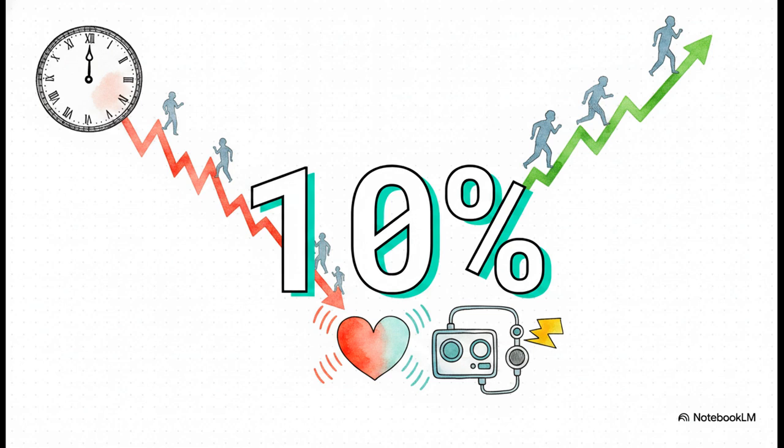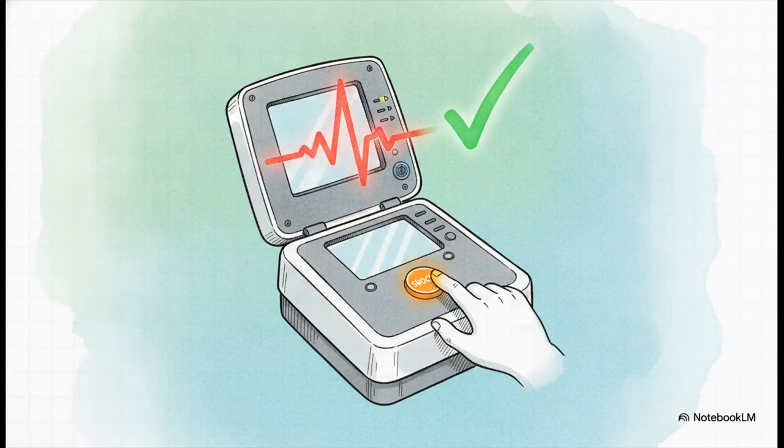Waiting around to find a device while doing nothing? Never the right call. But getting an AED deployed within those first few minutes can actually double or even triple the chance of survival. Now, here's a fact that should instantly take a huge weight off your shoulders. The AED diagnoses the heart rhythm, not you. It's incredibly empowering to remember that the device itself is doing the heavy lifting by reading the heart's electrical activity.